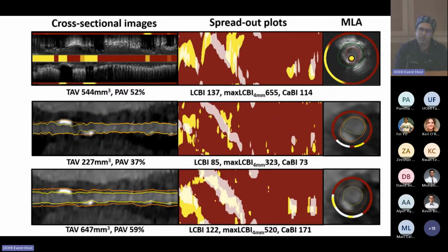As you know, in CAV, for example, we're interested in intimal thickness. So when you say plaque burden, that's quantitatively assessed invasively, and that characterization has incremental value above that. You're referring to the lumen area and not the plaque burden. Only because CLIMA in particular wanted lumen area, but the IVUS studies have all done plaque burden. Plaque burden is a better measure than lumen area. Anyway, yeah.